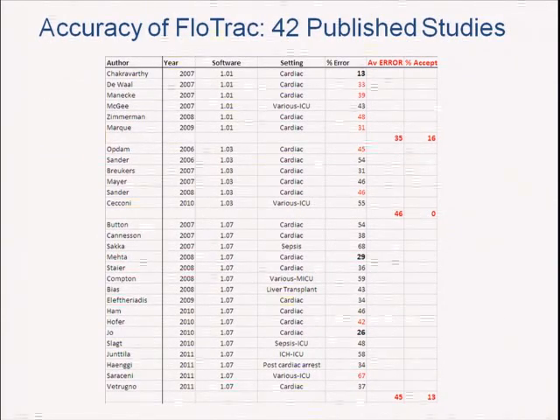So I was kind of interested in FloTrac because it's gained quite a lot of market penetration. It's the device which is often used in the operating room because it's easy to use. You just stick it on the A-line. And surprisingly, there have been a whole host of studies that have actually looked at the accuracy. So this is data which is published.